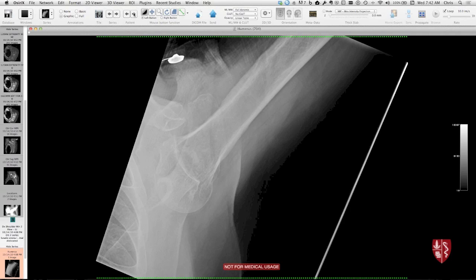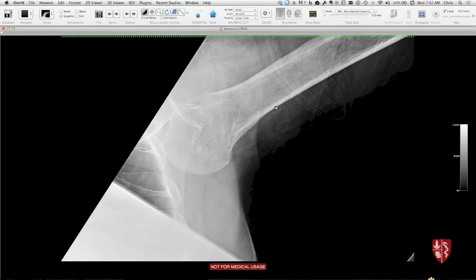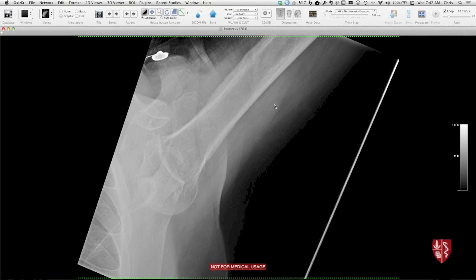Here's a different patient. This one's a little unusual because it's an atypical view — kind of a frontal view of the shoulder. So here's the glenoid here, and here's the humerus, and the arm is up. Does anybody know what this type of dislocation is called? It's kind of hard to get good views on patients that are injured like this. It's actually called luxatio erecta, and it's where the humeral head is dislocated typically anteroinferiorly, but the patient's arm is up because it's locked. So it's called luxatio erecta, or the 'teacher's pet,' because they're like raising their hand, offering to answer difficult questions.